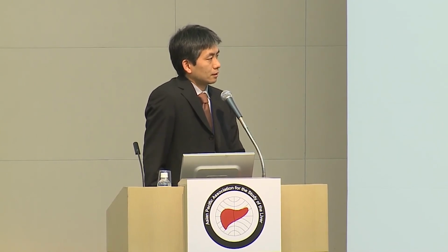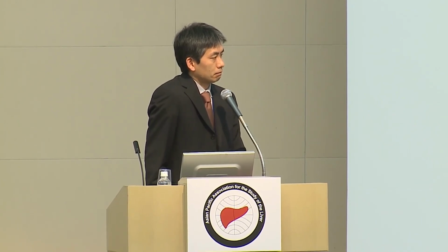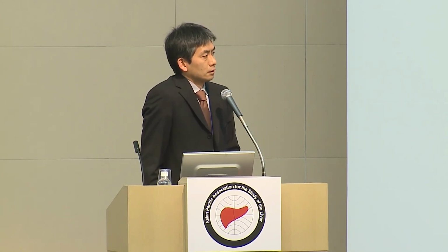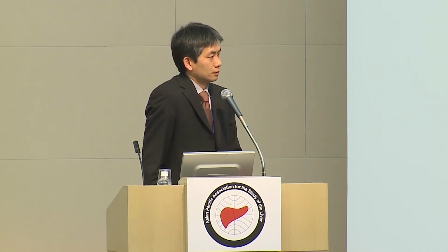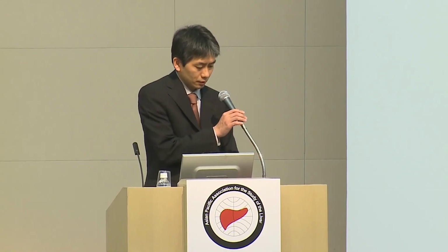So in the near future, do you feel that the guidelines, I mean the HCC diagnostic algorithm, may need to be changed, and contrast enhanced US should be involved more often? I wish so. You hope so? Yes. Okay. If not, thank you very much, Dr. Nishimura.